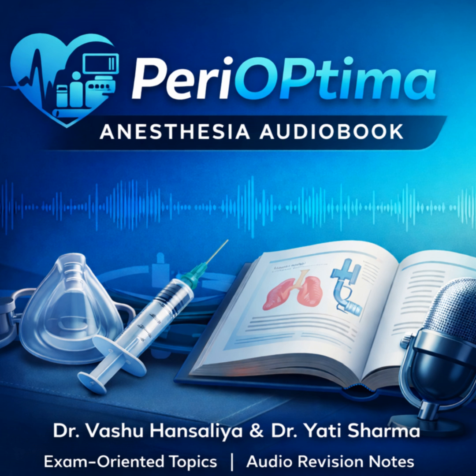And VV. Veno-venous, or VV ECMO, drains from a vein and returns to a vein, usually from the femoral vein to the internal jugular vein. Because it returns blood to the venous side, that blood still has to go through the patient's own heart and lungs to get to the body. So it supports the lungs only. It does not support cardiac output. The native heart must be working.